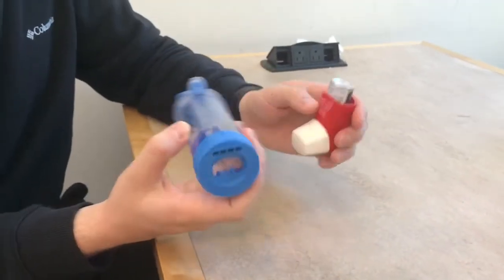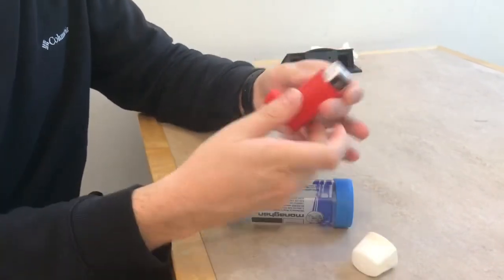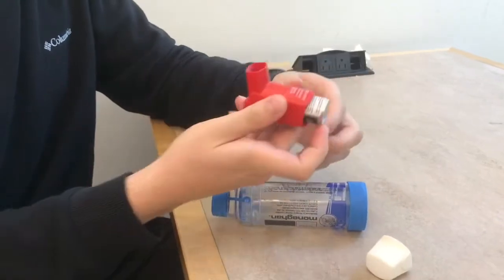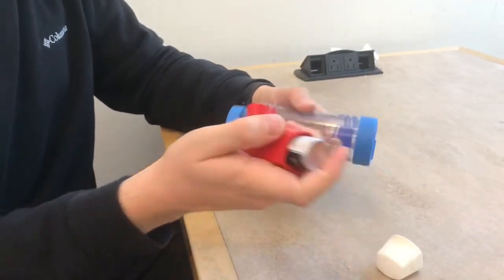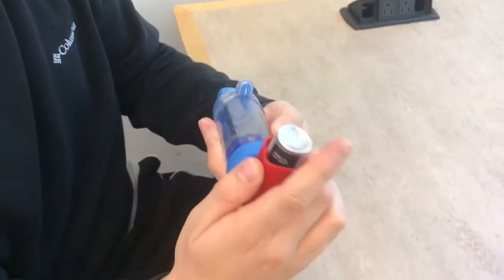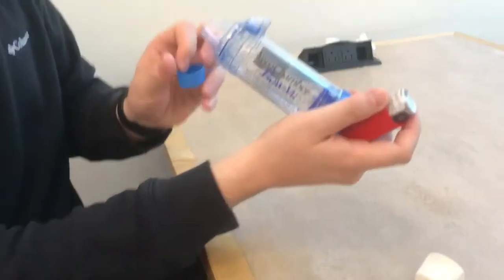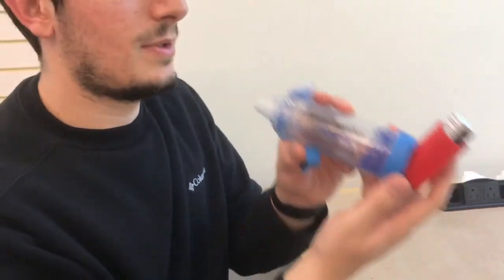Actually, this right here delivers the medication much better than if you were to just take it by itself. So you detach the cap off of your inhaler, use the chamber, insert it in the rubber portion like so, and then you pop the cap off where you're going to put your mouth on it.